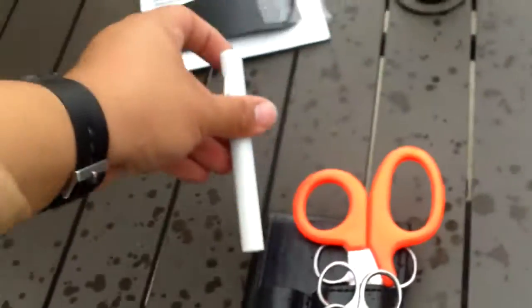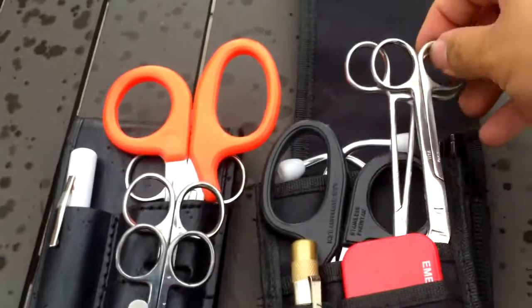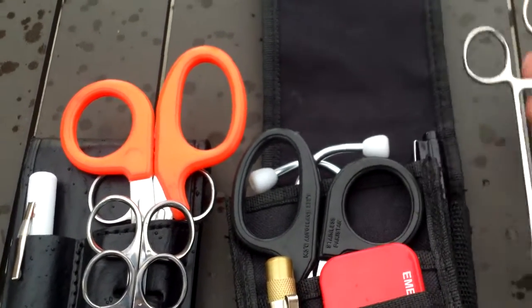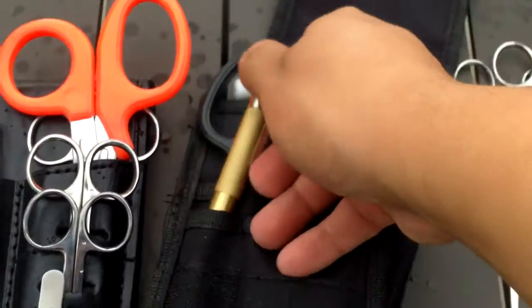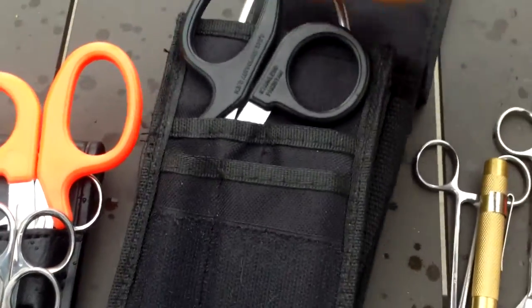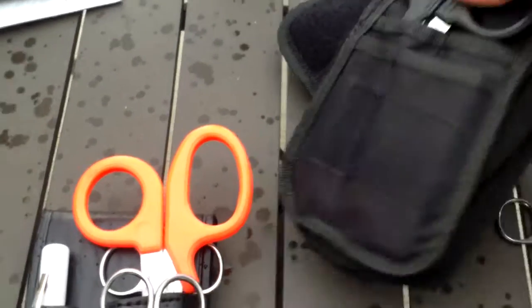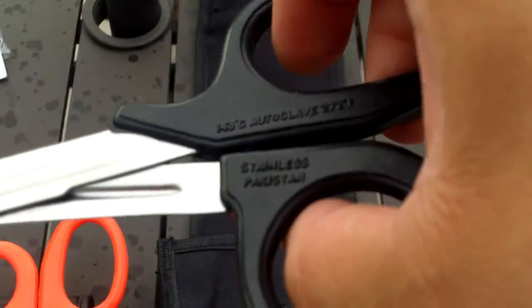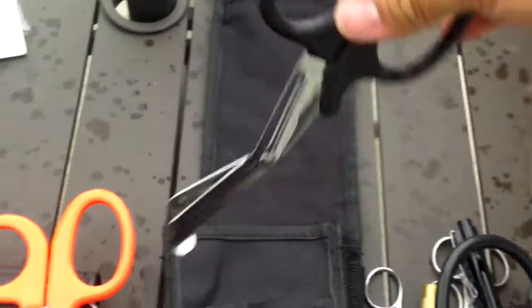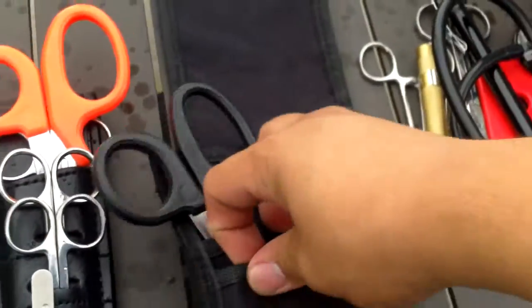I'll show you some other ones that are comparable on the market. Here is an EMI brand holster set. You get the clamps, the bandage shears, a seat belt cutter, a spring-loaded window punch, a reusable pen light, some very cheap but usable stethoscopes, and just the cheap Pakistan trauma shears. This pouch is rather big though.